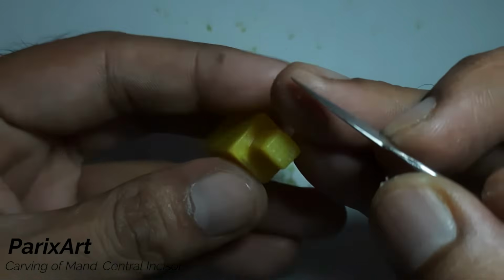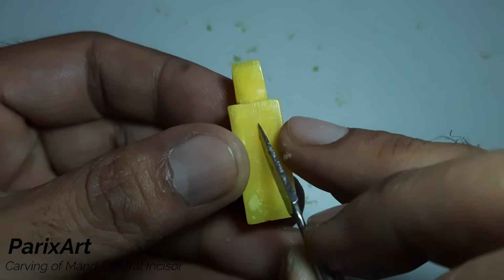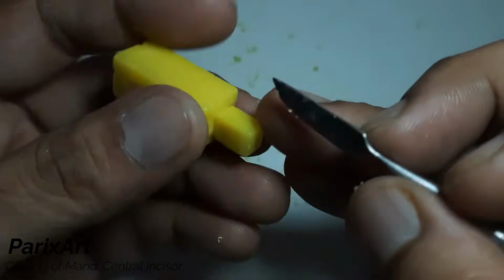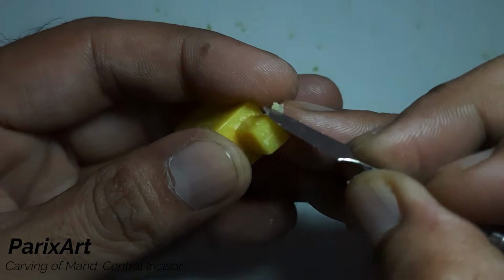Redefine the midline and start carving. First, closing to the midline. This will allow you to place the incisal edge lingually.